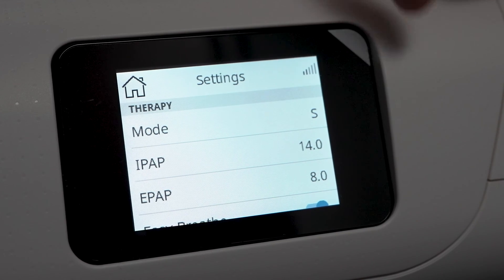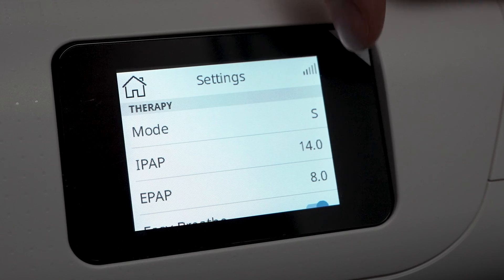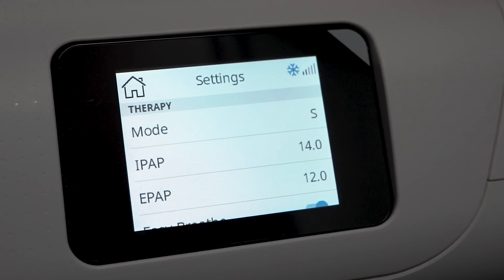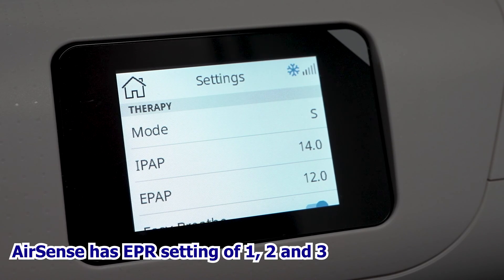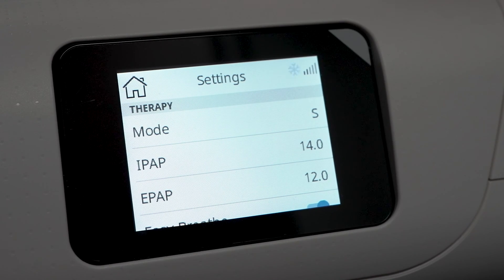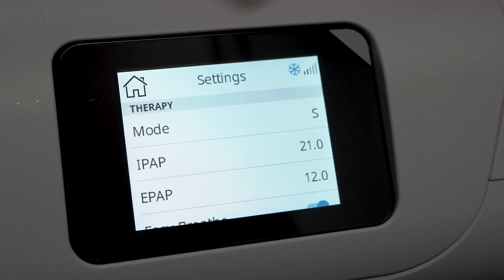If your pressures are close together — for example, an IPAP of 14 and an EPAP of 12, a difference of 2 — that is very similar to the pressure relief settings on an AirSense 11 CPAP under the EPR setting, where you can have a pressure variation of 0, 1, 2, or 3. So a difference of less than 3 is very comparable to what you can get on a CPAP machine, but the AirCurve allows a much bigger variance if you need it.